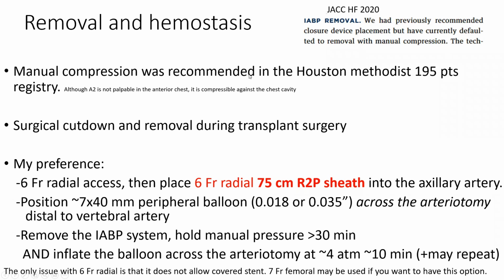Manual compression was recommended in the Houston Methodist 195 patient registry. Although the A2 segment of the axillary is not palpable in the anterior chest, it is compressible against the chest cavity. Keep in mind, again, the axillary artery is outside the chest. So if you push hard, you can compress that artery against the chest wall. So that was recommended in that series.